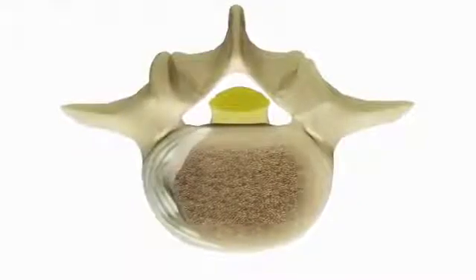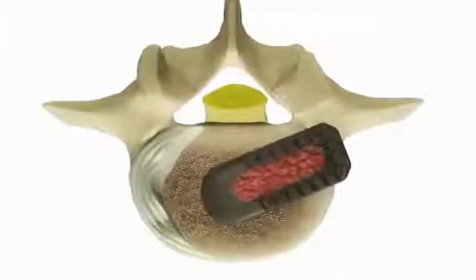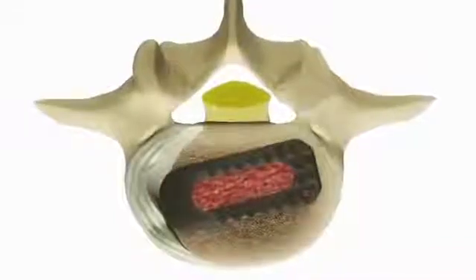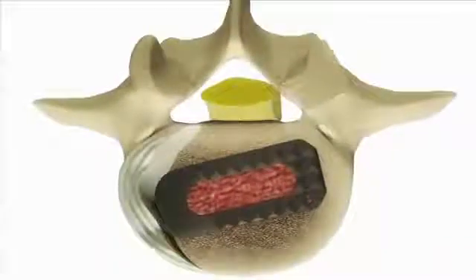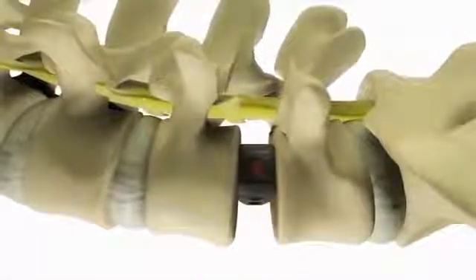After measuring the size of the space, the surgeon inserts an implant made of bone or a synthetic material into the disc space. This implant gives critical support to the spine and aids bone fusion.